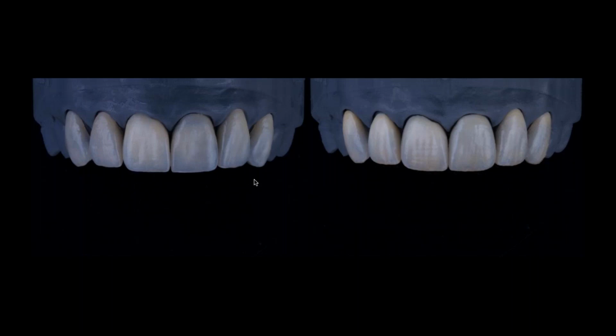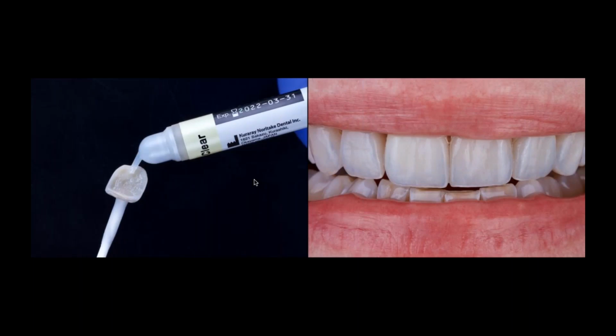It's a very strong material. As we know, lithium disilicate is very strong. This is a lithium disilicate, and we can also etch it with hydrofluoric acid, as I'll show you in a minute, and bond it. So it's a very safe material to use both in the anteriors and the posteriors. Here I'm showcasing both possibilities, the micro veneering or the stain and glaze technique, as you see in the photo on the right side. Then I received the package, and we go ahead and do the try-in.